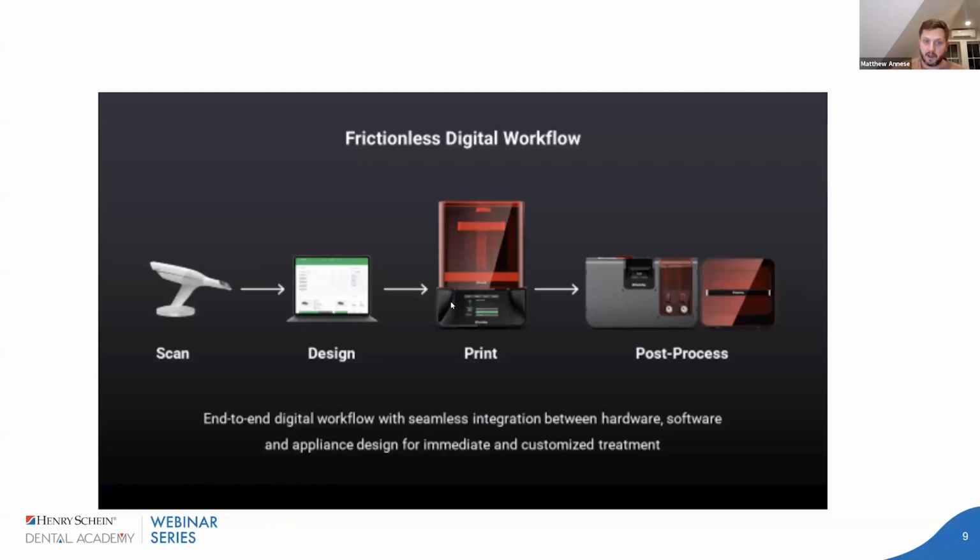Is it something where now you need 3 different parties and it just accepts any STL, PLY? So there's something to consider: is there a home base, or are they trying to build a home base that can communicate directly with your printer? That way you're not going through that extra step, and you can use the power of AI, the power of outside design, to streamline.